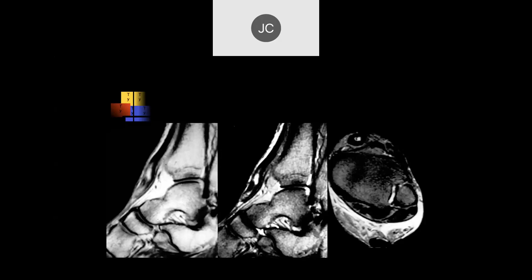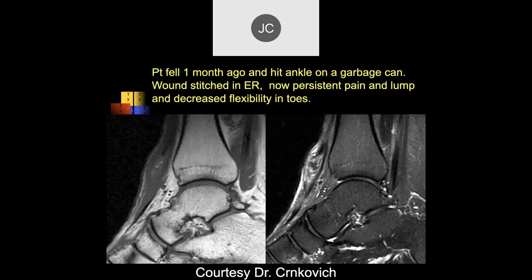This is a complete tear — the tibialis anterior was completely torn off its attachment to the medial cuneiform and retracted back with fraying of the distal fibers. Like we've talked about elsewhere, first you get tendinosis and weakening of the tendon, then finally you have rupture. That's a tibialis anterior complete tear with retraction.